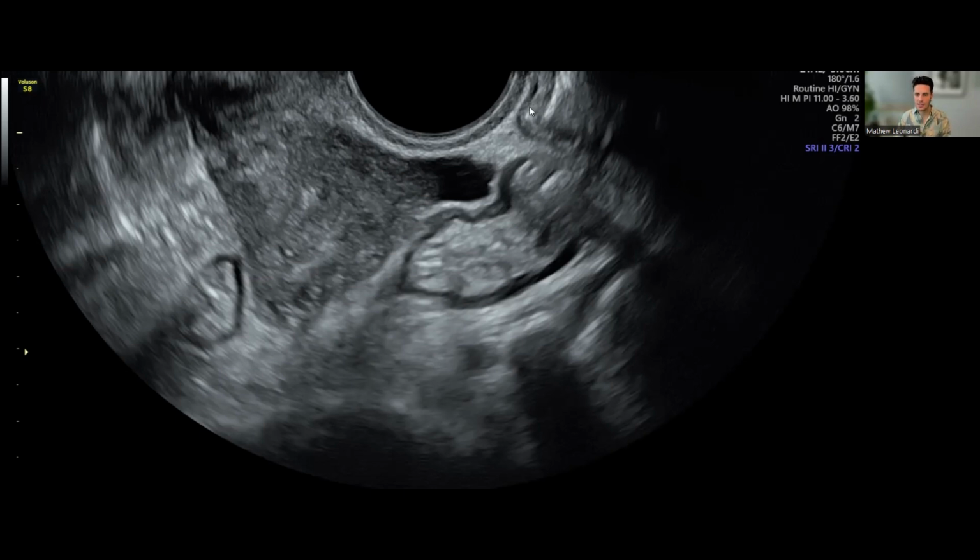So we have here that retroperitoneal rectum, rectovaginal septum, vagina. This here is the very base of the rectouterine pouch. There's that fluid again. And in this particular area, you can sort of see probably where that bowel fold is going. And this is exactly where it enters the pelvis.